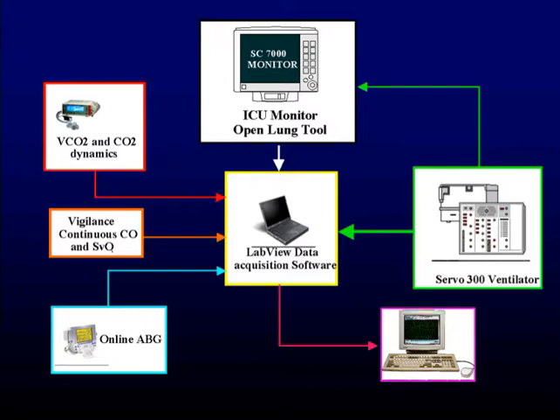What it mainly does is follow on a breath-to-breath basis the evolution of pressures, the plateau pressures, the PEEP levels, and the dynamic compliance. Specifically, we're trying to study the ability of dynamic compliance to detect or describe the process of recruitment, and especially to detect the collapse of the lung.